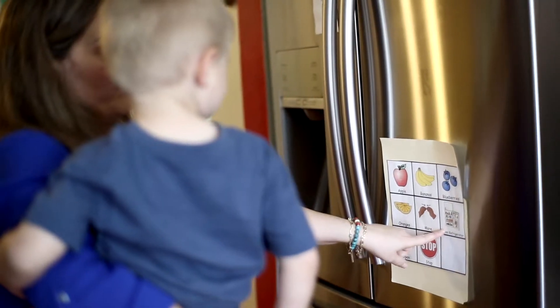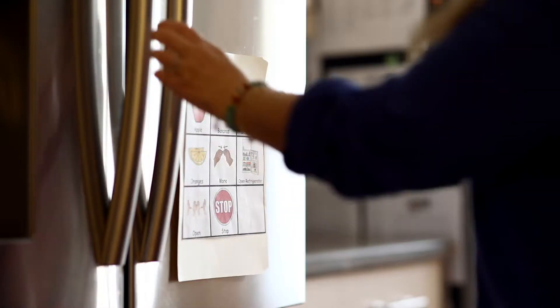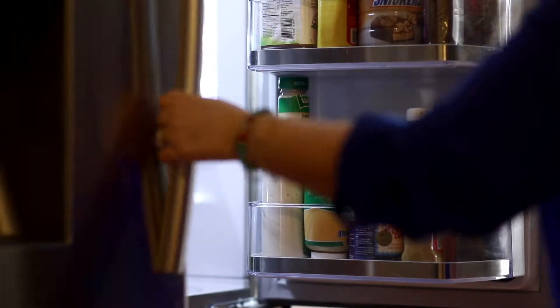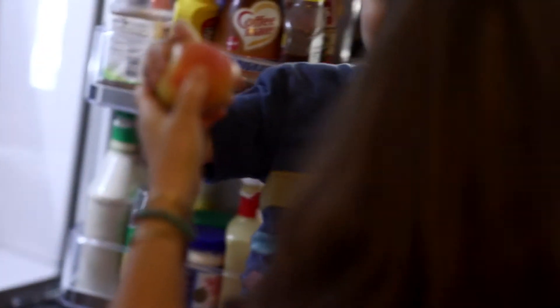Mom asks: "What do I need to do to get you the apple?" Dylan responds: "Open!" Mom says: "Let's open and find that apple, Dylan! Here we have our apple!"